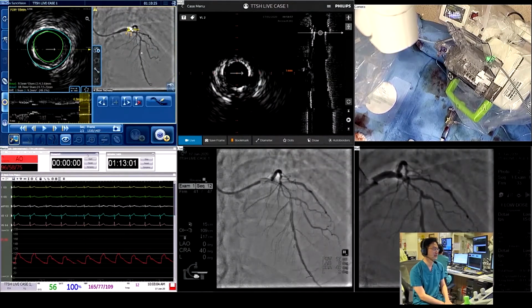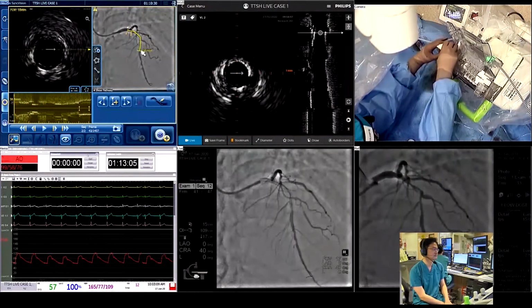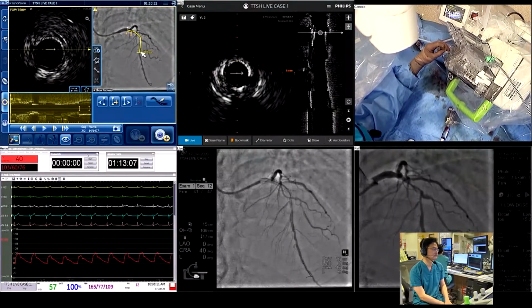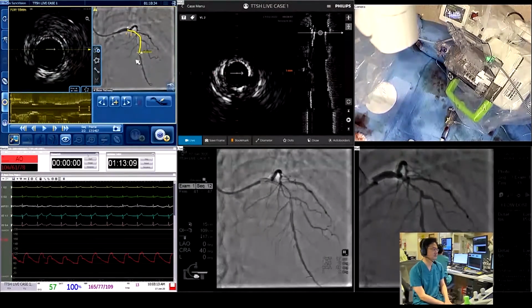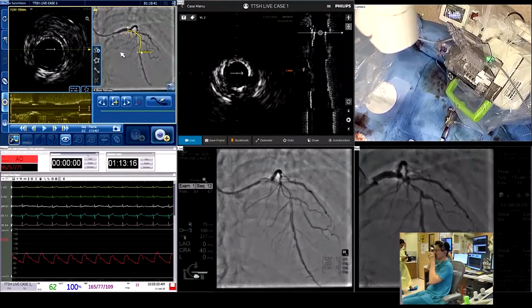I just want to highlight as well that currently Tock Seng, we are participating in a PRECISION GRX registry. So we are comparing how accurately we measure the lesion length by the conventional approach versus the robotic system. So that will give us some results in the future.